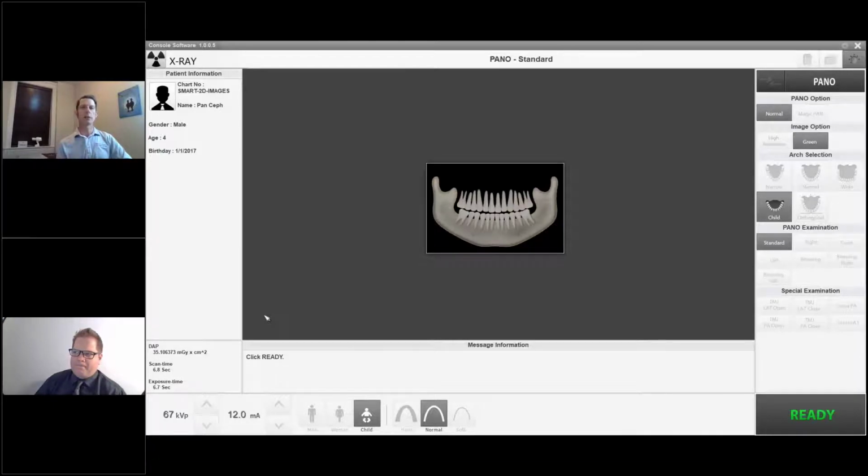We're going to cover that soon, but really telling them that we're going to be lining up and moving your head around and tipping your head up and down and lining up some laser beams. They know what's going to happen. So it's going to have them be more relaxed, and also it's going to give them a better patient experience at your office, knowing what happens there.